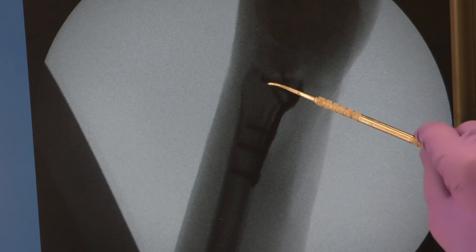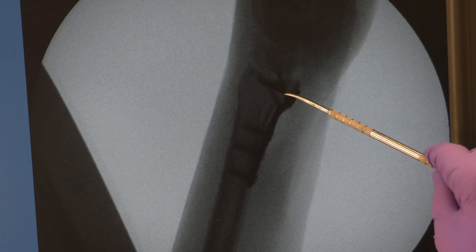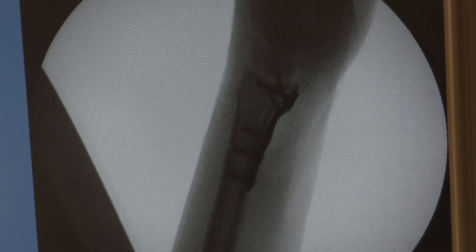Screws only need to be about 75% of the width of the lunate to be adequate in length. There was a good biomechanical study showing that only 75% of the width of the lunate needs to be the length of your screw to provide the same biomechanical fixation as screws longer than that.